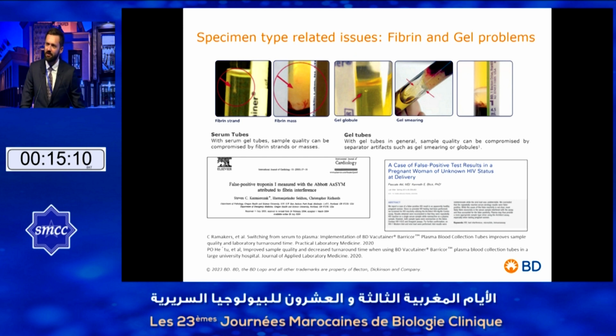Second difficult choice. We all know that for chemistry and immunochemistry, in most cases, we use serum. Serum to run the specimen for most chemistry tests.